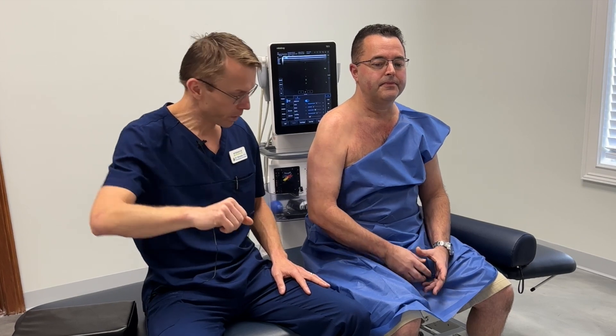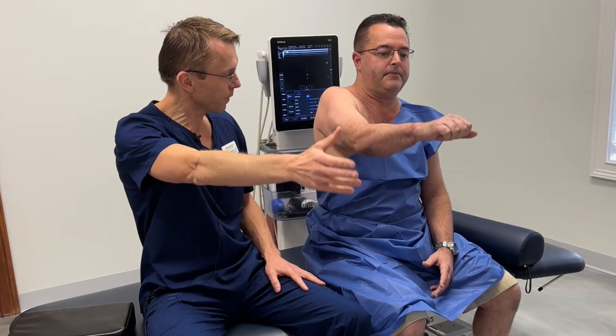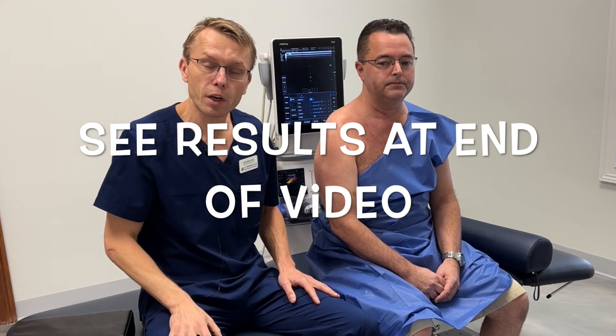Vincent, can you show me the movement? That's all he's got right now. How about forward? All right, very good. So I'm going to go ahead and do hydrodissections on the cervical nerve roots and we'll see how he recovers.